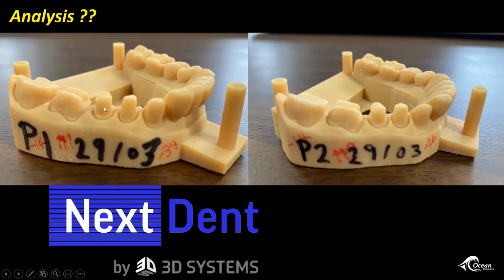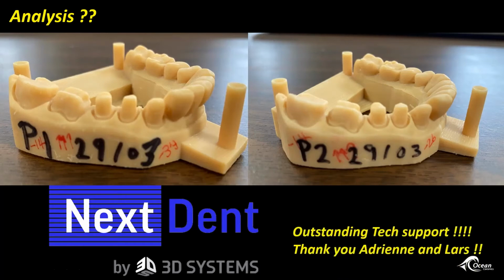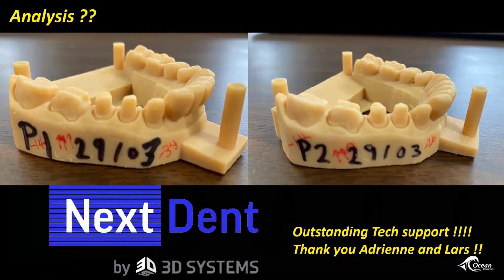If I had to wax something on here, would it be accurate? And so this is like 3 arrows up, which is amazing. But the journey I went through is I went to the tech support and engineers at 3D Systems. Adrian, Lars, you guys are amazing tech support stars that helped us out, because we literally got these contacts dialed in to amazing accuracy. This stands for printer 1, this is printer 2, and I don't have printer 3 on here, but everything is consistent, which is fantastic. So thank you guys if you're on screen, if you're logged on.